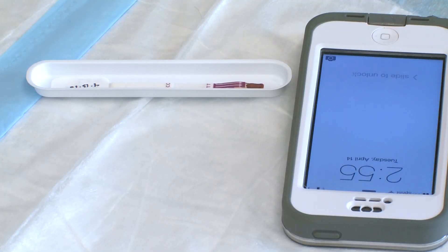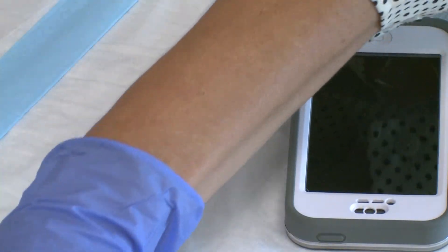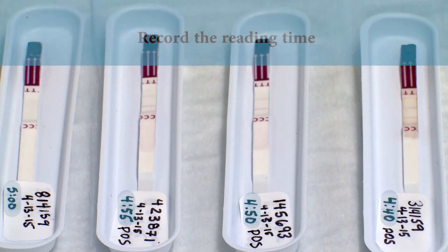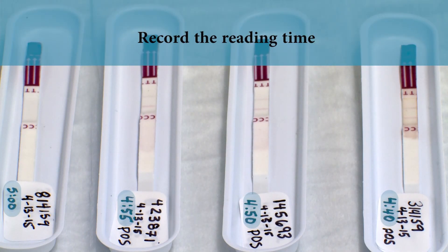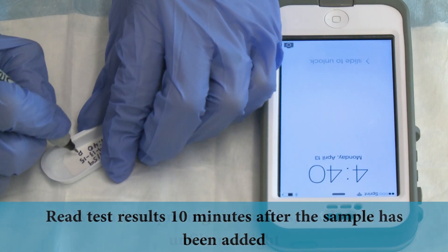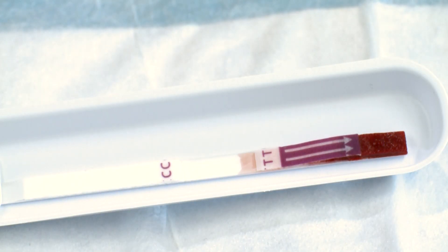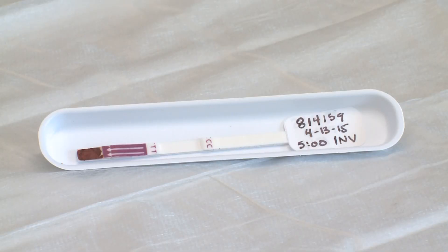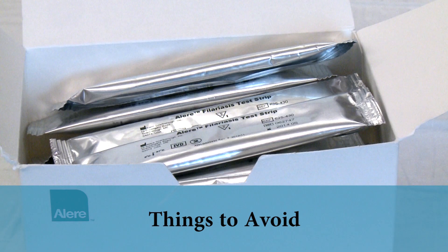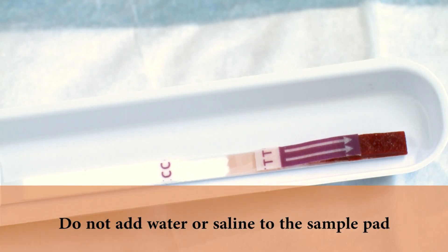A clock is often used as the timer. The start time should be noted and 10 minutes should be added to determine the time the test is to be read. The reading time should be written on the plastic work tray or label. Recording the reading time is critical to help with organization when multiple tests are being conducted at the same time. Read test results 10 minutes after the sample has been added. Test results should be read using bright, unfiltered light — faint lines can be difficult to see when lighting is not adequate. If the sample fails to migrate all the way up the strip in 10 minutes, the test is considered invalid and should be repeated if possible. You should never add water or saline to the sample pad to increase the rate of sample flow.